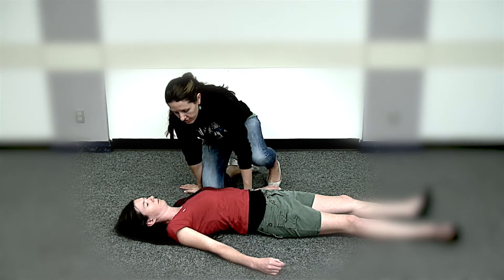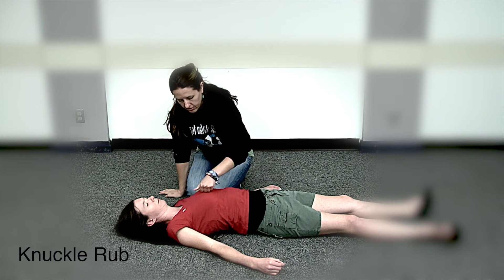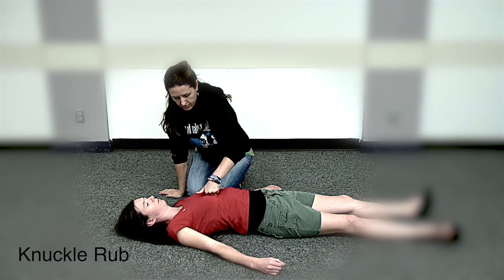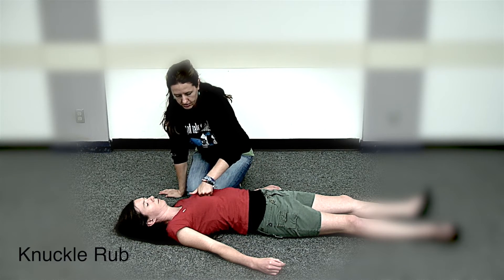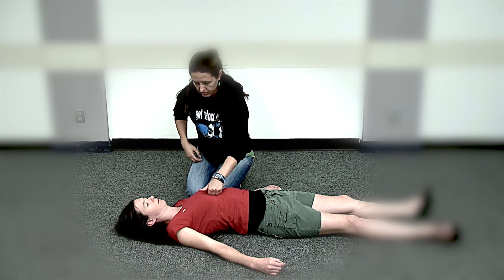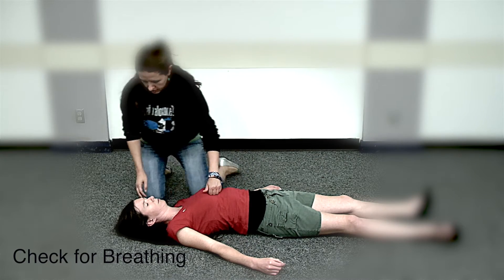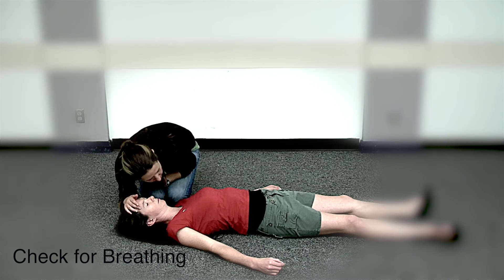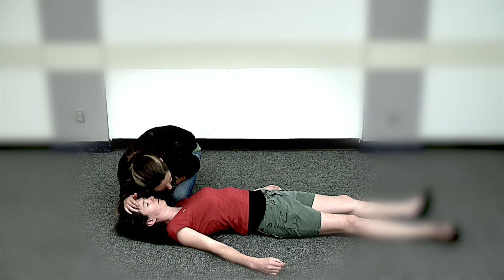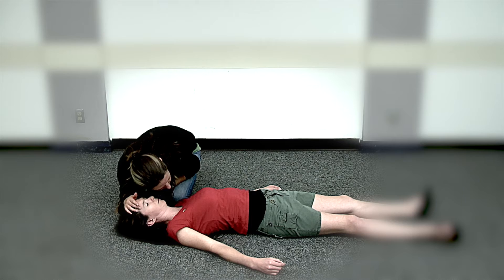The quickest way to see if the person is responsive is to take your knuckles and rub them firmly up and down the person's chest bone. If the person does not respond, check for breathing. Watch their chest to see if it rises and falls. Put your ear near their face to listen and feel for breaths.